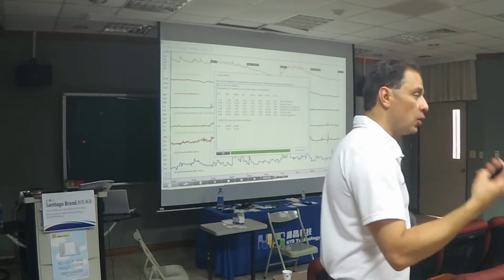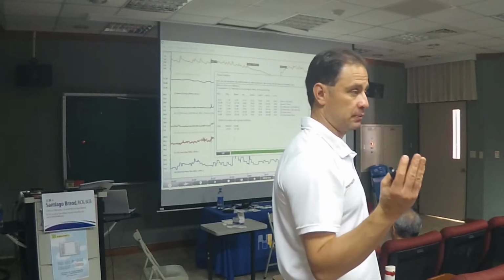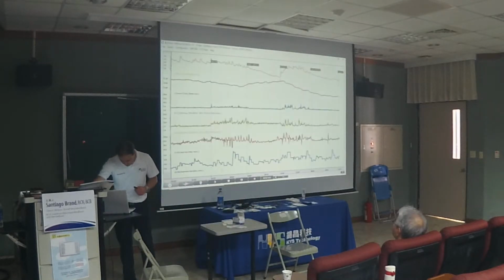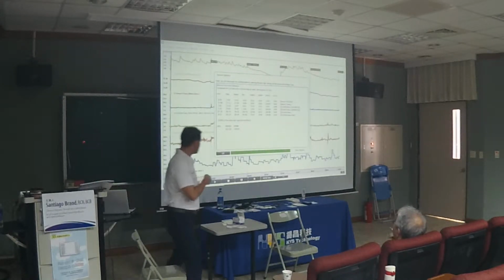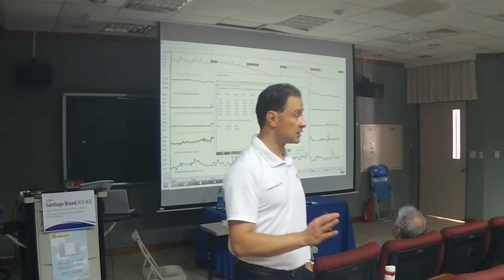Now we're going to go on to the stress one phase. And what do we expect the values to do? To go up, right? How high are they going to go? Well, we don't know. So we'll see. So again, drag, and there we go. So respiration went up to 19, which is expected. And why is it expected? Because he's talking.